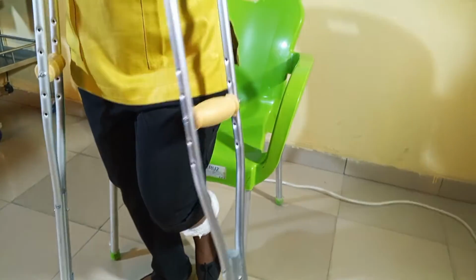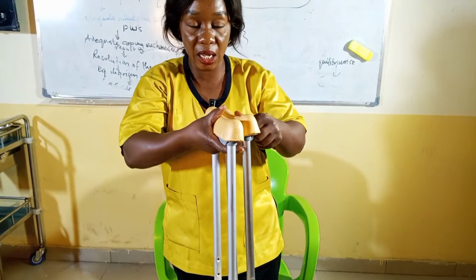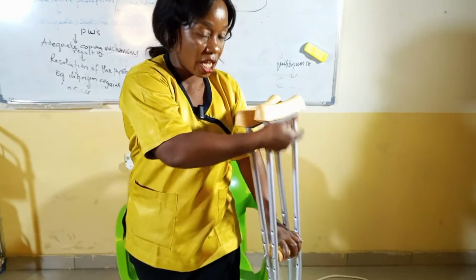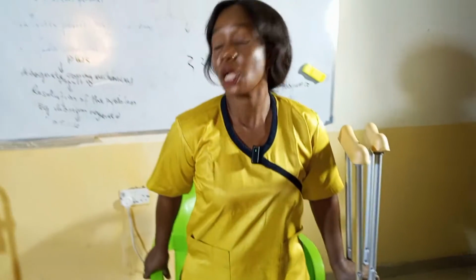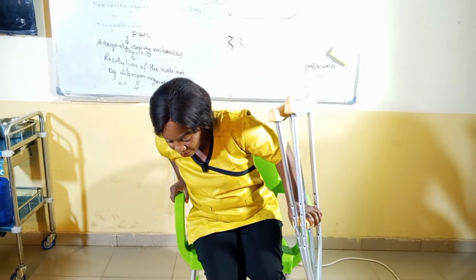Then you remove both crutches, put them together in the left hand, and bring them to the side this way. Then use the other hand and support yourself on the armrest of the chair, and then you sit down, right? Remember, it's no weight.